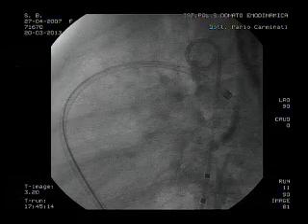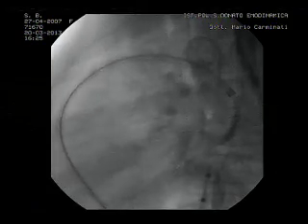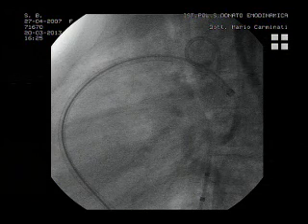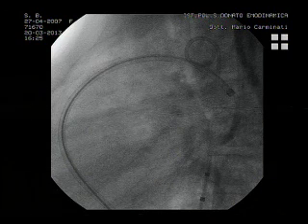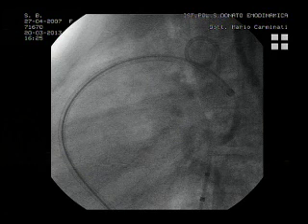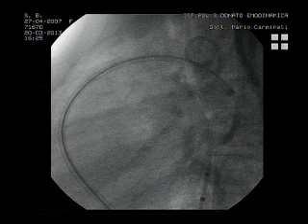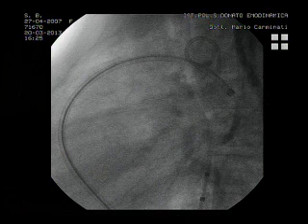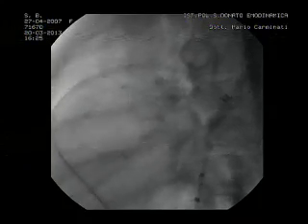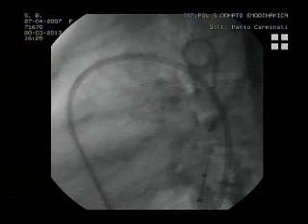Yes, please. Can we have the microphone here in the front, please? Hello? Yes, Mario. This is Francisco Garay from Chile. Just to be a little provocative, I have to say that we have been closing this kind of elongated ductus with the vascular plug 2, the AVP2. Yeah, it's elongated, so that's why... a possibility here, in spite of the advice we took from most of you to use an Amplatzer ADO1, is that we could go ahead and use an ADO2 here, or an ADO2 AS, long enough to sit in there.